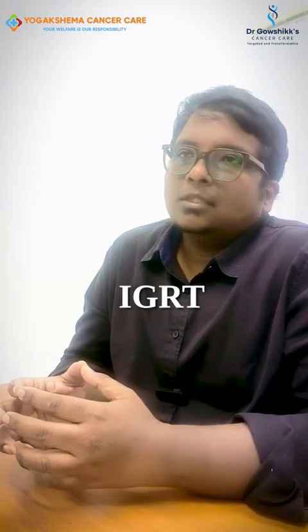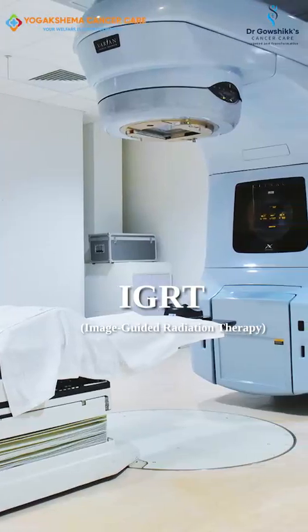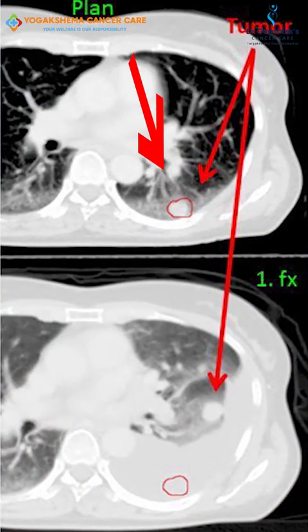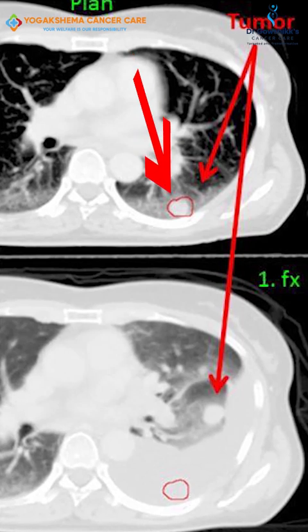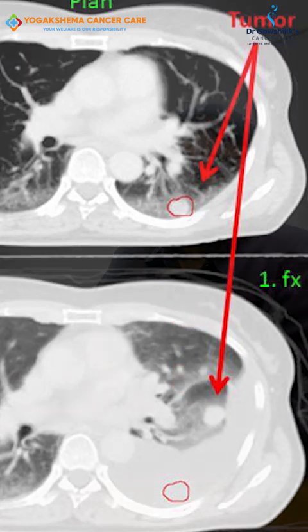Next comes the IGRT, image guided radiation therapy. This is nothing but IMRT, but with daily imaging. What is this daily imaging, you may ask? In IGRT, each and every day we take an image before starting the treatment. With that, if the organ is moving every day, one day the organ is in one place, the next day the organ has moved a bit, and the tumor has also moved. If we don't have image guidance, we might be treating the site where the tumor is not there. In such setups, IGRT is more useful.